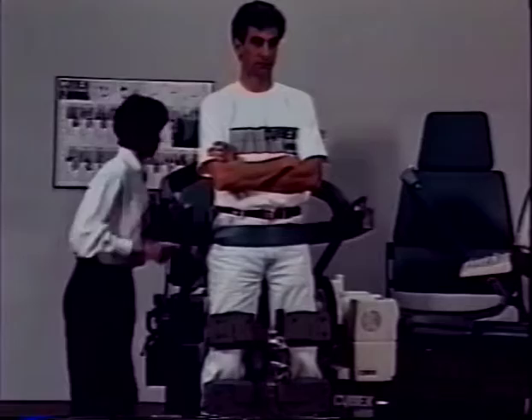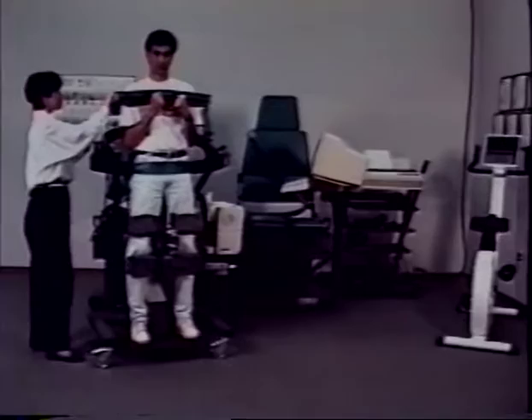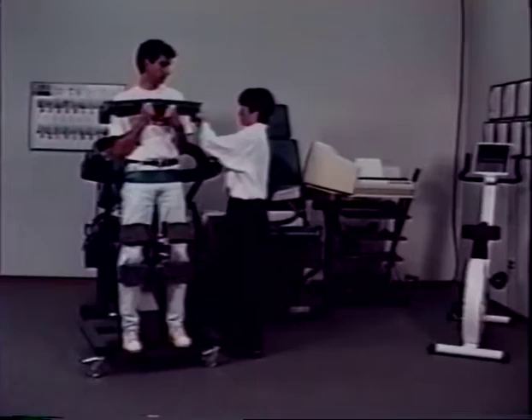Finally, to stabilize the trunk, hand the patient the curved chest pad. Insert the buckle into the flat metal end and then tighten the belts on both sides.